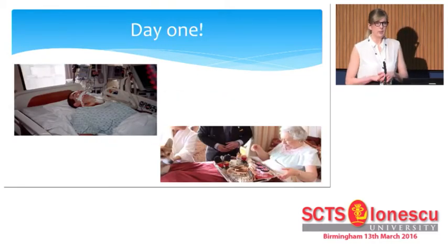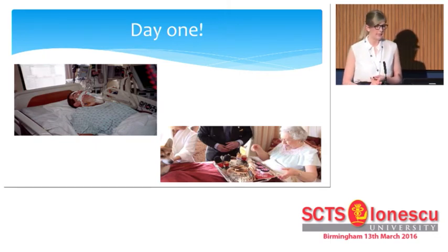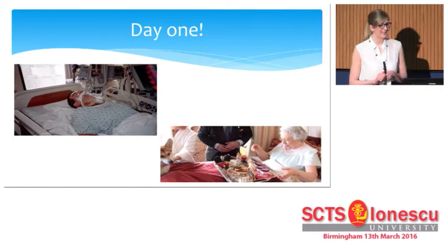So day one, I came up to our critical care unit to see this patient, knowing that he was on VA ECMO, but not knowing the cannulation techniques that would be used or how stable the patient would be. And to give you an idea, some of our emergency VA ECMO cases are often intubated, sedated, paralysed, and can be quite unstable. Whereas often our peripheral VA ECMO cases are just done with sedation, so they don't require intubation, and they don't require a sternotomy. And due to the elective nature, they're cannulated at a much more stable point.